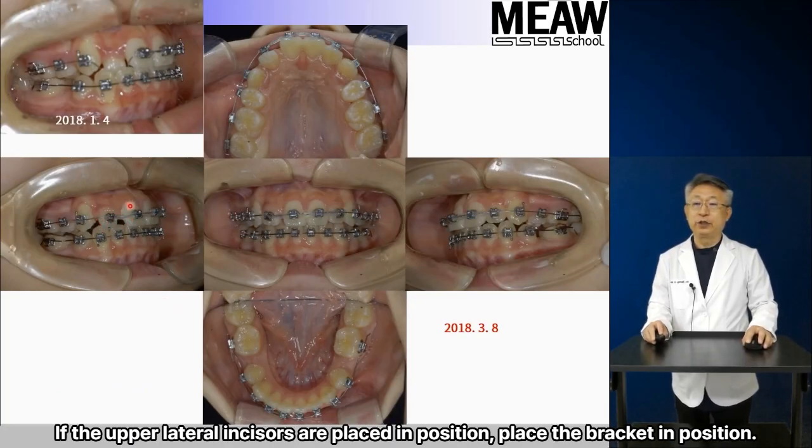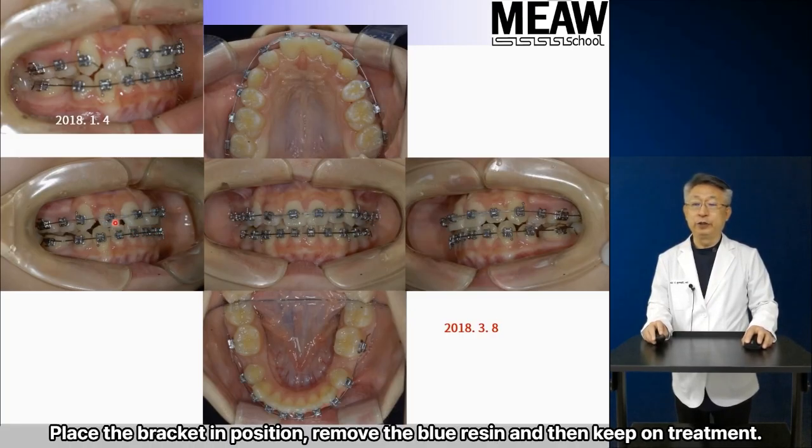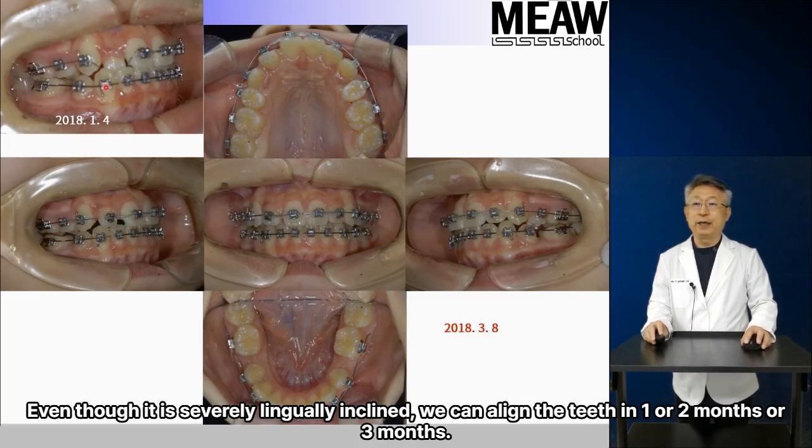If the upper lateral incisors are placed in position, place the bracket in position, remove the blue resin, and then keep on treatment. Even though it is severely lingually inclined, we can align the teeth in 1 or 2 months or 3 months.